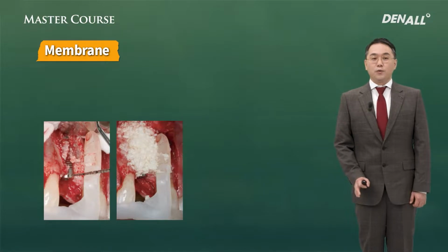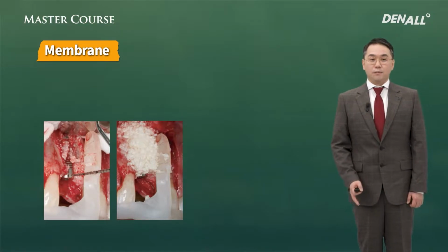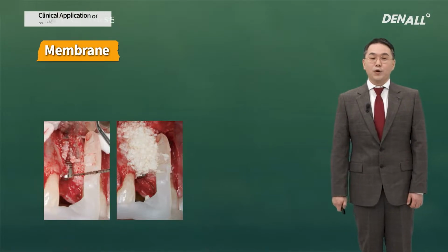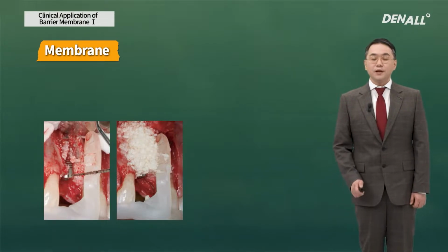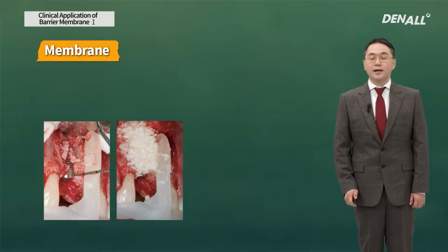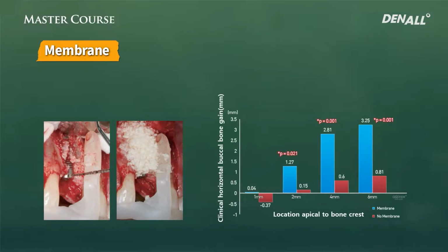In one group, bone graft is covered with the membrane. In the other, periosteum is used to cover the material. The volume of graft material is measured accurately using prefabricated stent. If you look at the graph on the right, the group which did not use the membrane showed bone resorption.